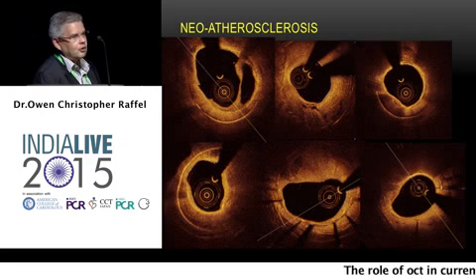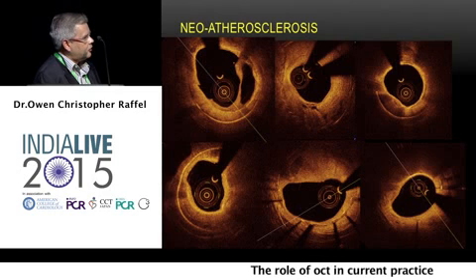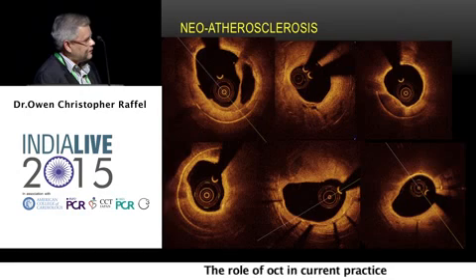Neoatherosclerosis, also increasingly an issue with stent thrombosis, very easily and nicely seen. This is a prior healed ruptured plaque. You can see little calcified nodules in neoatherosclerosis in there. This is a lipid-rich plaque in neoatherosclerosis through an old GFX stent.